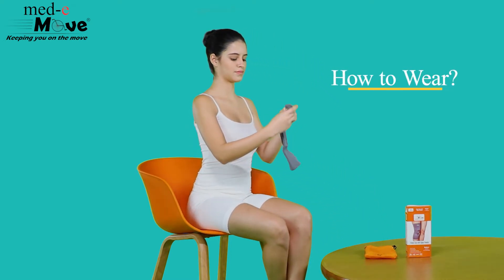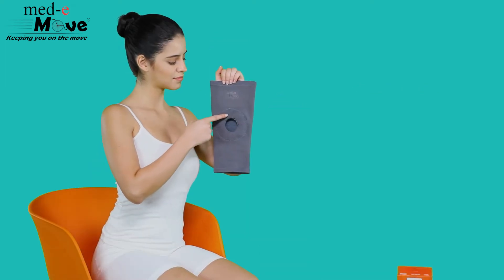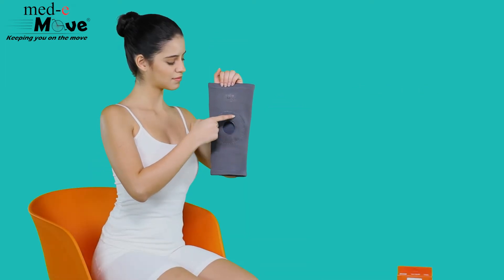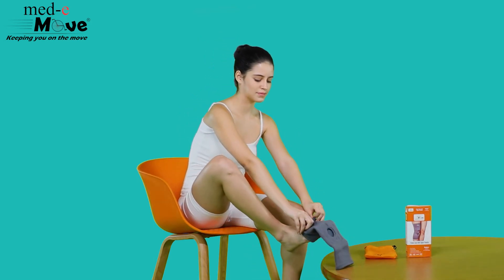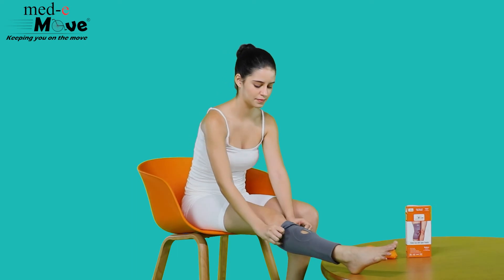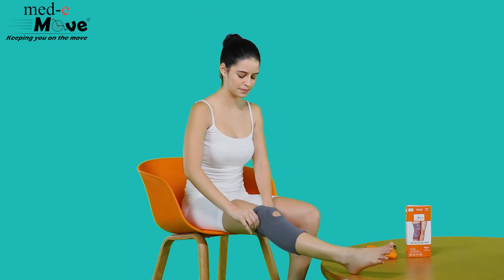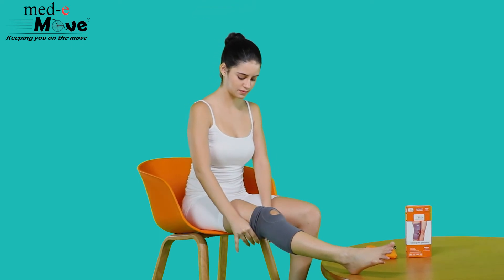Now let us see how to wear the Medimove kneecap with open patella. Ensure the kneecap is worn with the broader side upwards by slowly pulling it towards your mid-thigh. The silicone ring provided in the kneecap must cover the patellar joint of the knee.